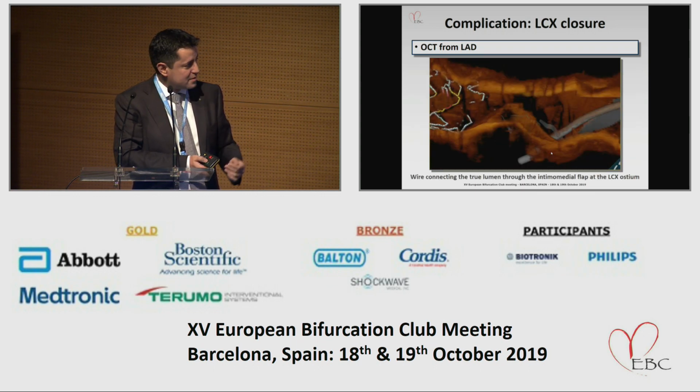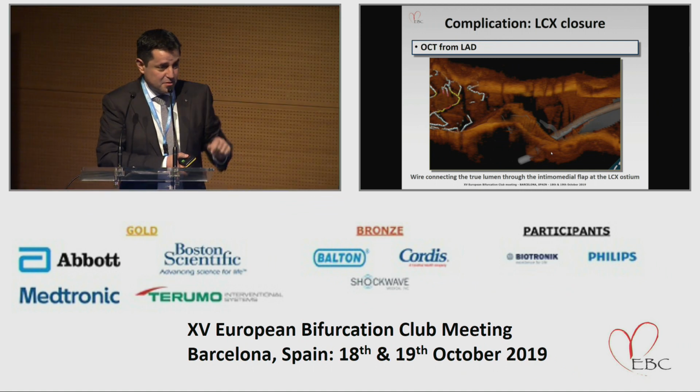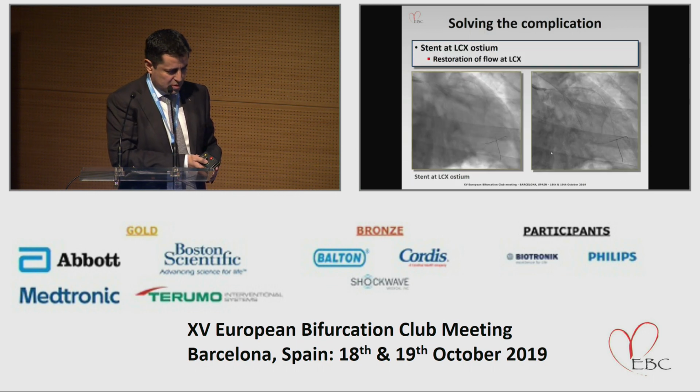Fancy, you know, Chico, what is really impressive here is that you have to be a Sherlock Holmes if you want to understand the pictures on IVUS, where everybody can understand the pictures on OCT. That's very clear. Yeah. This was the remark that guy sitting there made, and it convinced us to do the OCT just to document it very nicely. 3D is nice, but in this case it's useless to understand that.